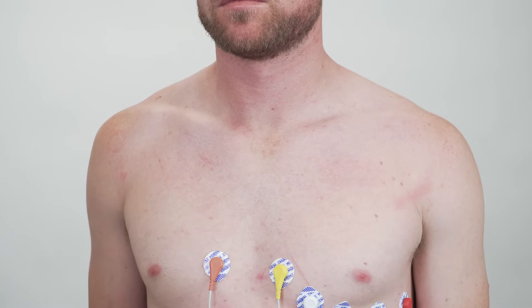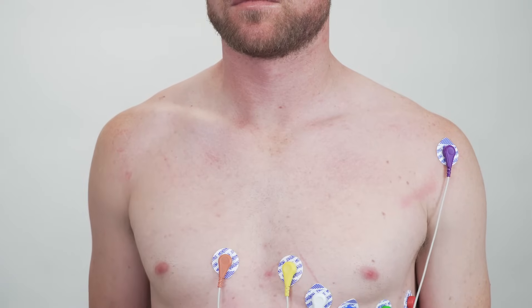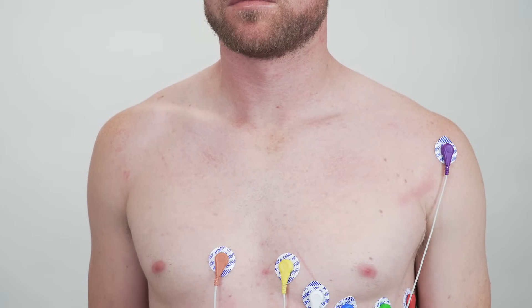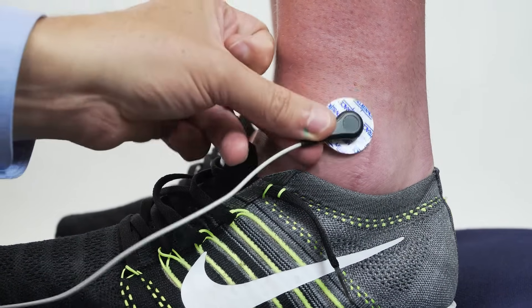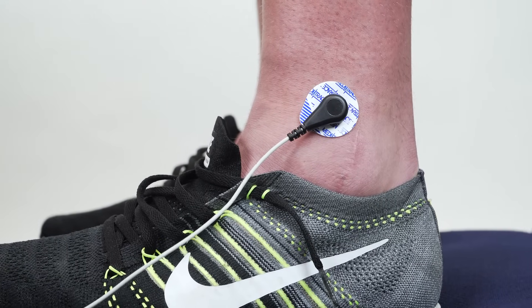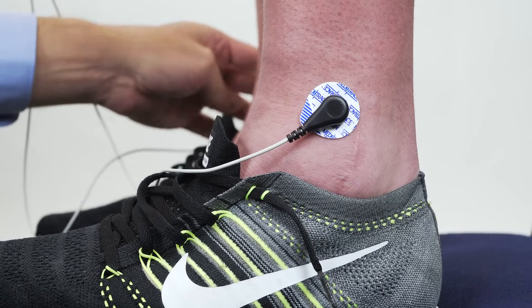Now we're going to stick on the limb leads, lead 1 and lead 2. First we're going to stick on the left arm — try and stick it on somewhere where there is not a lot of muscle movement, because that'll just cause EMG. Put on the right arm, and then we can connect the left leg, which is the reference for all the augmented leads. Lastly, we can stick on the common, which goes to the ground input on the octal bioamp — stick that on the right leg.